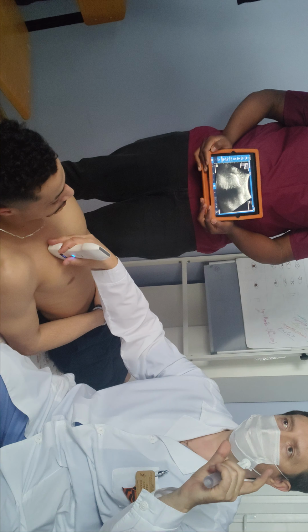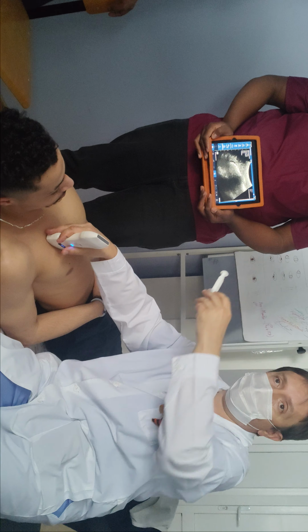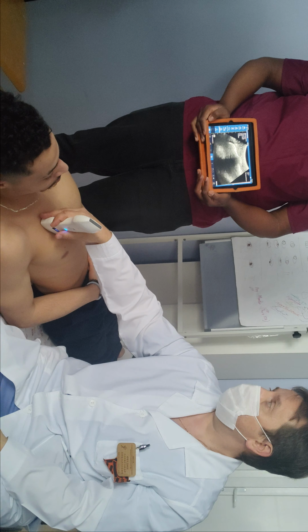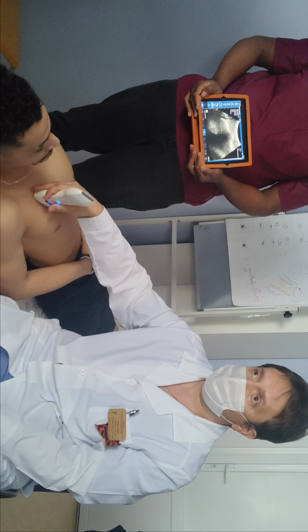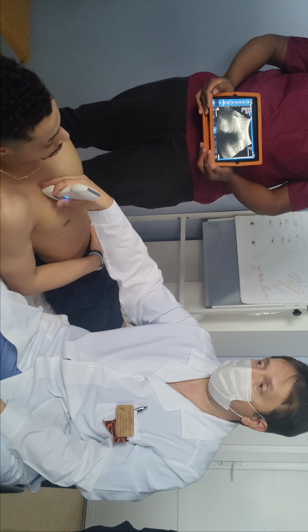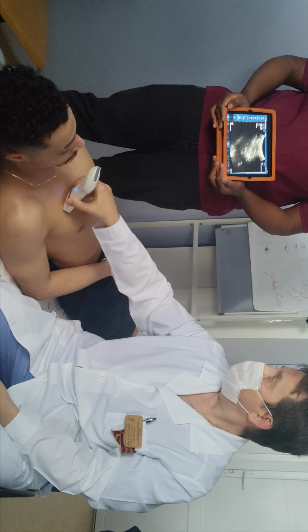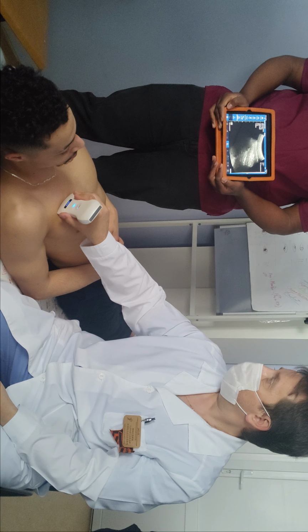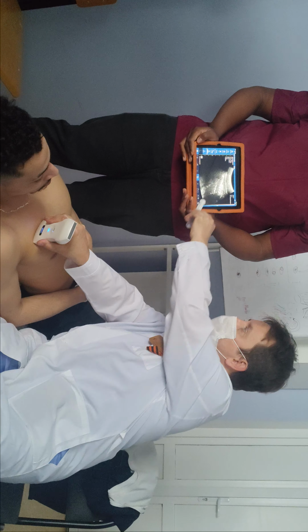If we have a distance between that line, that gray, it is a tissue of the lung, normal tissue of the lung. If we see distance between the pleura and some other parts, what does it mean? We have a pneumothorax, or blood. But for assessment, we should place the probe in that direction and see the best overview of lung tissue. Again, we see the pleura, we see the tissue.